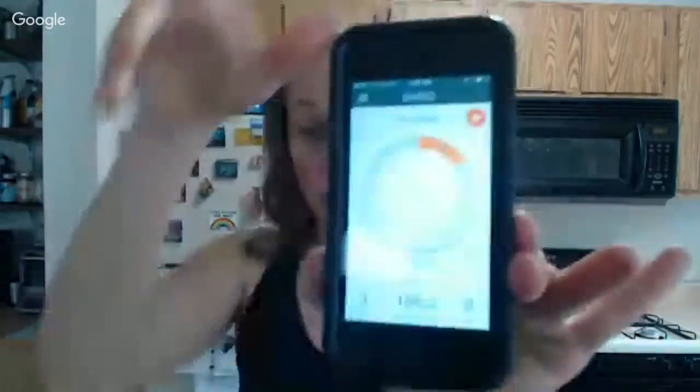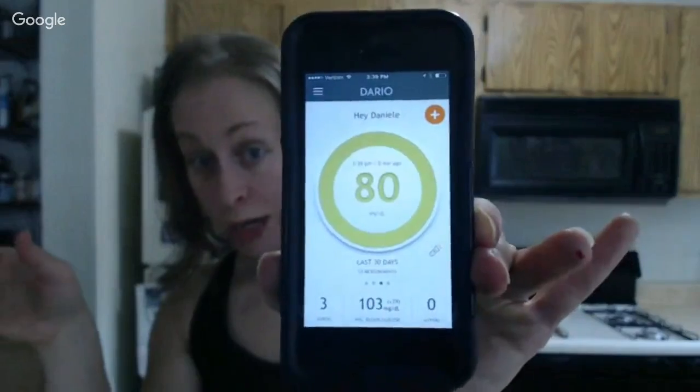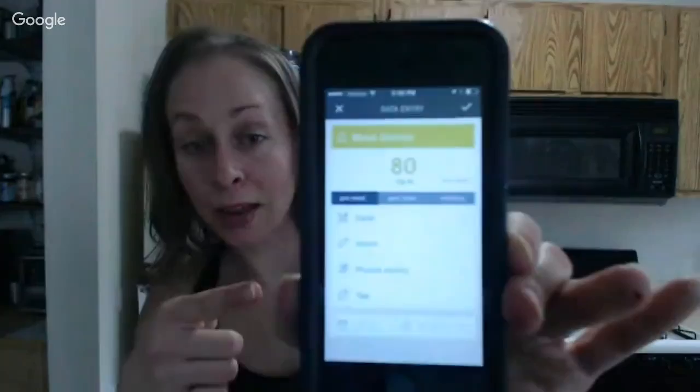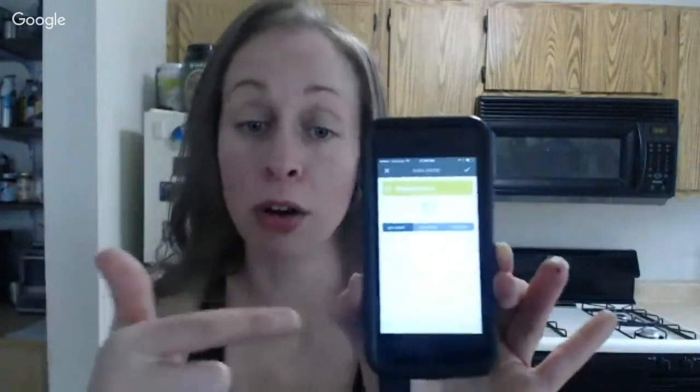What I want to do is bring this back up so you can see it is measuring 80. Wonderful. So now that's in there, and it's asking me, do you want to tag this? Have I just had any carbs? Is this pre-meal, post-meal, bedtime? So right here is where you put in all the information. Physical activity, gives you the time, all that good stuff.